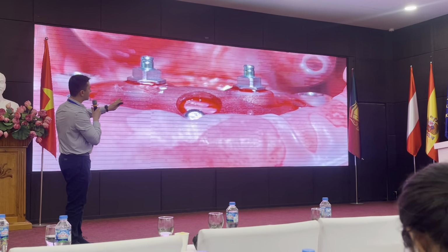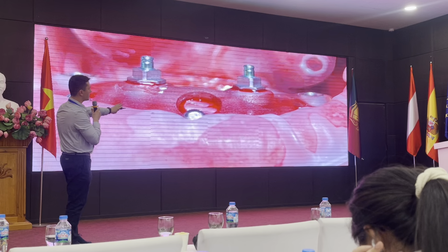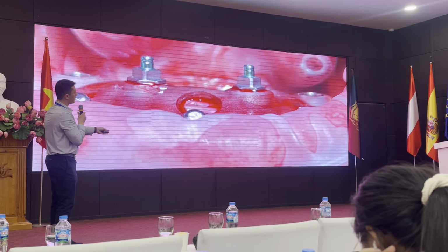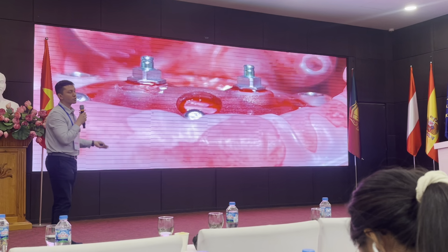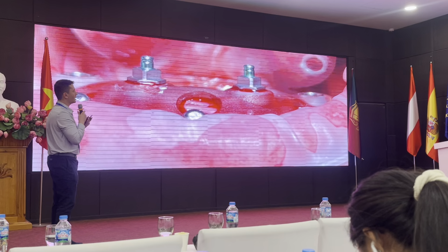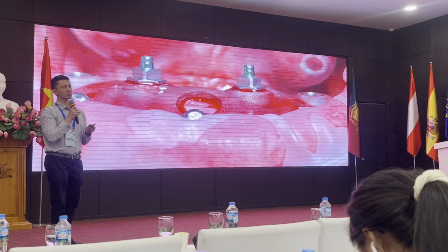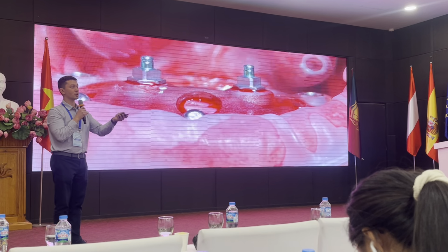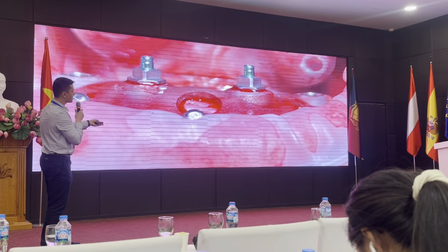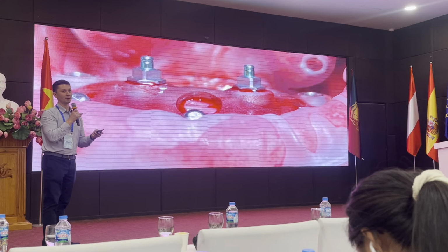For this case, because we're doing a locator implant overdenture, it's really less critical that they match. But if you were planning to place angled multi-unit abutments, like what Dr. Kim was showing earlier, these matching hexagons are what we call timing.